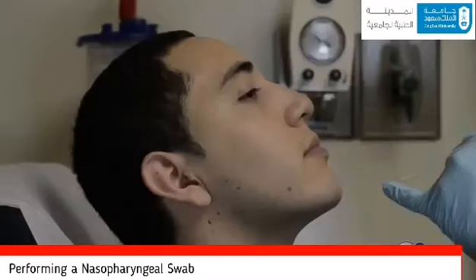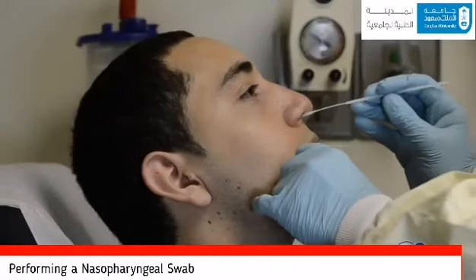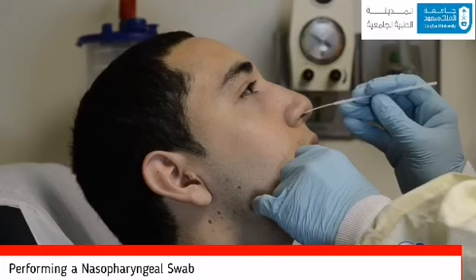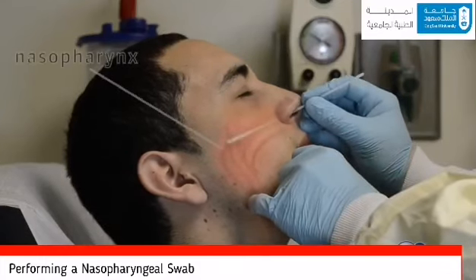First, slightly tilt back the patient's head so that the nasal passages become more accessible. Gently insert the swab into the nostril. Keep the swab near the septum floor of the nose, while gently pushing the swab into the post-nasal pharynx. As a visual reference, the swab should be inserted at about half the distance from the opening of the patient's nostril and the ear.